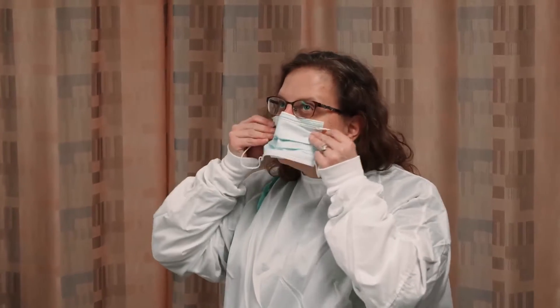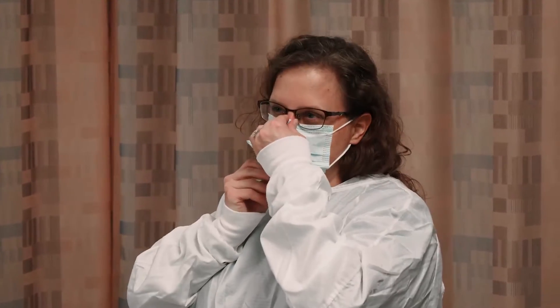Now for the handy dandy mask. Always blue side out if you're using a surgical mask. We can also use an N95 as well.